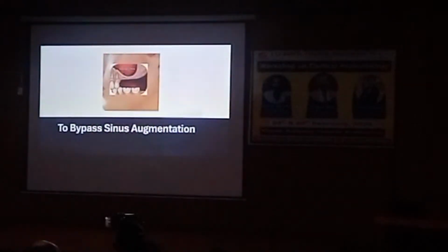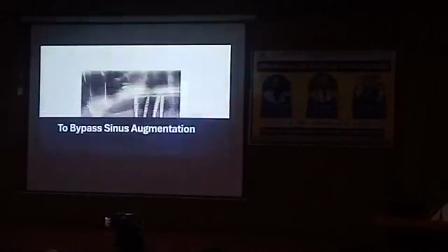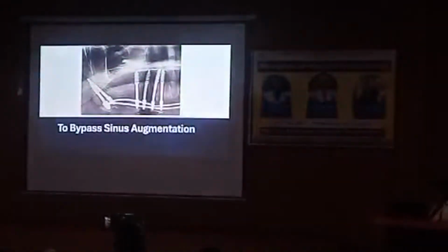why we need pterygoid is to bypass sinus augmentation. Not everyone can excel in sinus augmentation, or not every sinus augmentation will lead to a successful outcome. First you do a first surgery, sinus augmentation, then wait for 3 months, it passes or it fails, then you will plan for a full mouth case. Can the patient wait? No. Can you risk such a long period of your practice waiting for one patient after doing a sinus lift? So in such cases, we bypass sinus augmentation if you know the correct pterygoid technique.